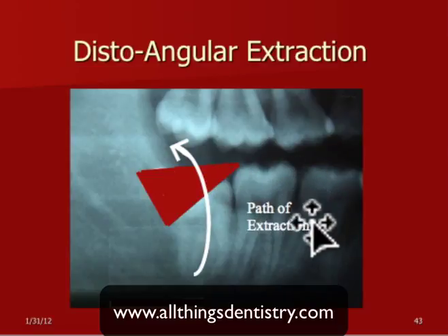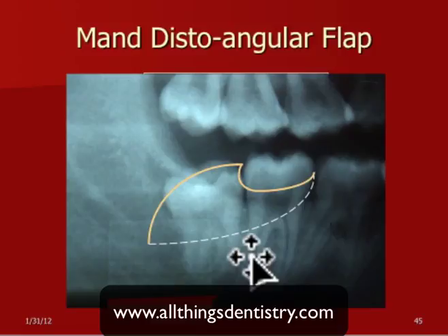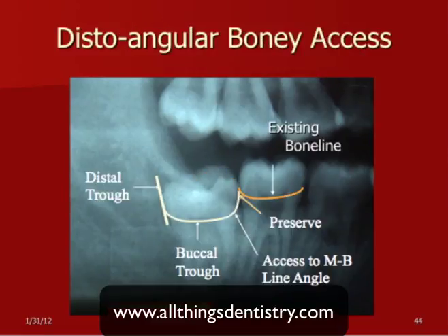One other side light I might answer here. Let's see, you may see it better on the next. That's the way. Once you take that out, then the tooth should extract right out through that open spot there. Did I miss the bony reduction? Oh, there's a bony reduction there, sorry. A bony reduction again, you just do a simple buccal trough here and a little bit of the distal there. And that should give you plenty of room to access the tooth so you can section the tooth properly.